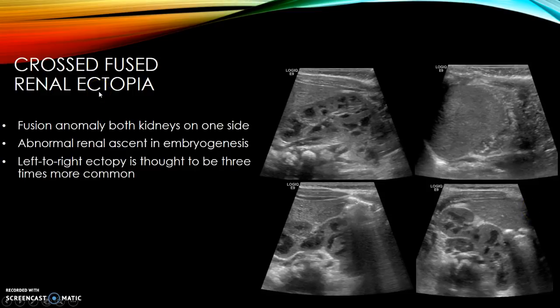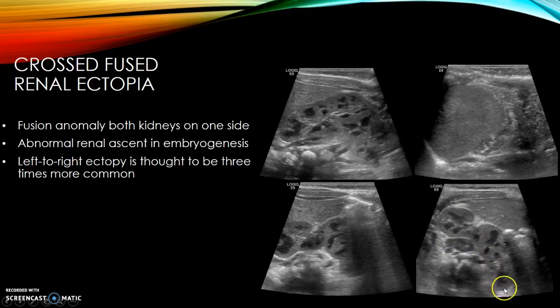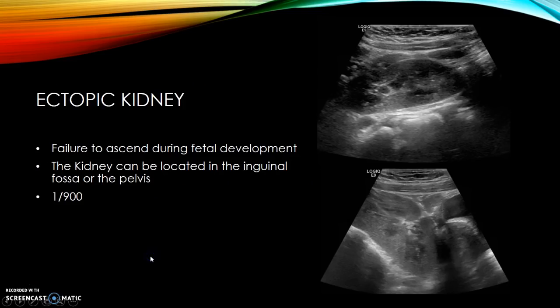Another fusion anomaly is crossed fused renal ectopia, where both kidneys are located on one side and are fused, sometimes forming an L-shape. On a sagittal view of the right side you see the right kidney with the left kidney jutting out from its lower pole. The left renal fossa is empty. On transverse you see the right kidney transversely and the left kidney more longitudinally, connected to it. Left-to-right ectopia is about three times more common, so you'll more commonly see it on the right side.